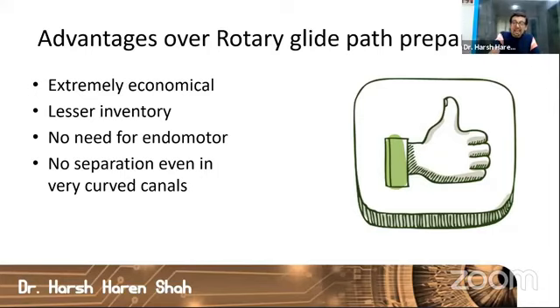Now, if you compare it with rotary glide path files, I'll talk about rotary glide path files in detail in the forthcoming slides.